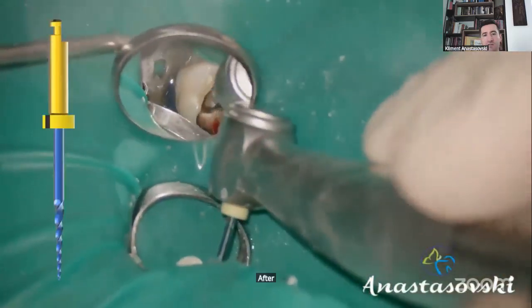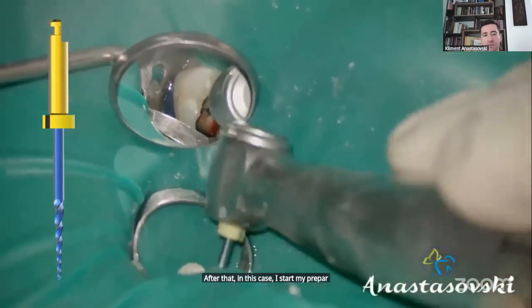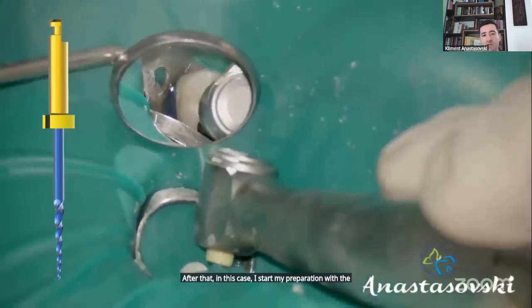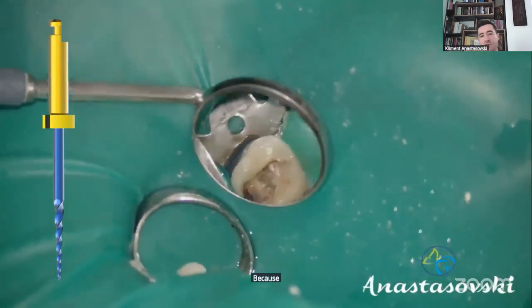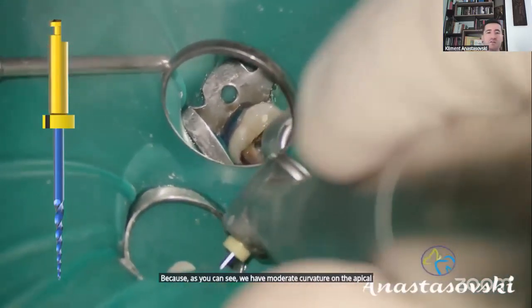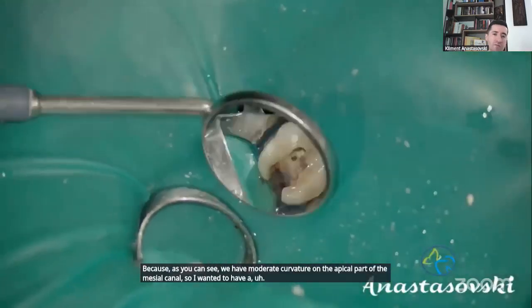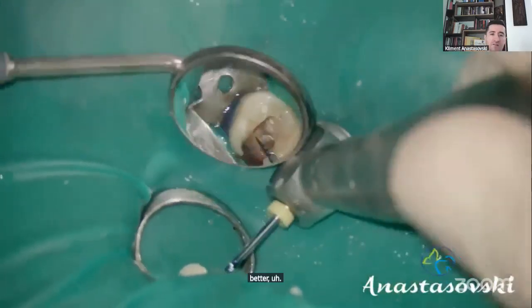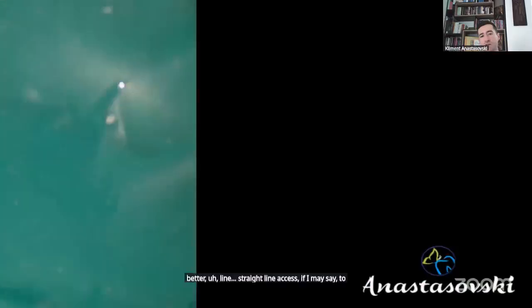After that, in this case, I start my preparation with the orifice opener file, the RR, because as you can see, we have moderate curvature on the apical part of the mesial canal, so I wanted to have a better straight line access, if I may say, to the mesial canals.